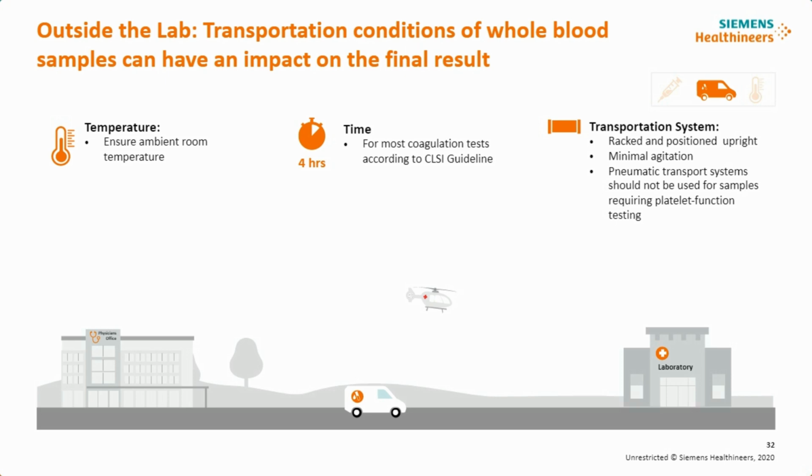Racked, position, upright, minimize agitation. If we're looking at pneumatic transport systems, assessing the pneumatic transport system.